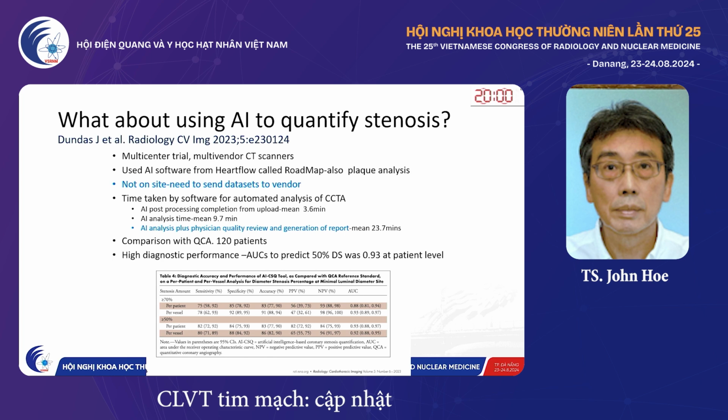This is another paper published last year, again, multi-center trial with 4 major vendor CT scanners used. They use software from HeartFlow. Again, it's not on site and needs the data sets to be sent to the vendor. Again, the time taken to analyze was very fast, but it still needed to be checked by a doctor before the report was released. And again, the accuracy is high.